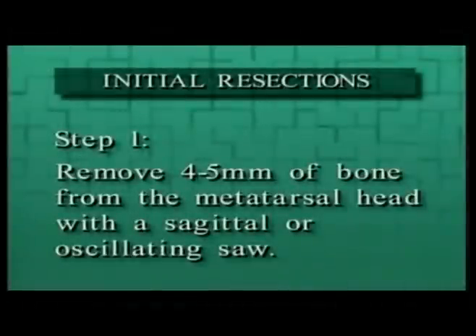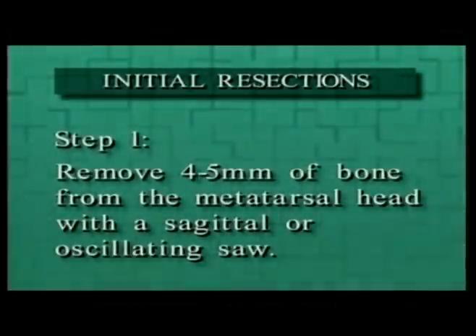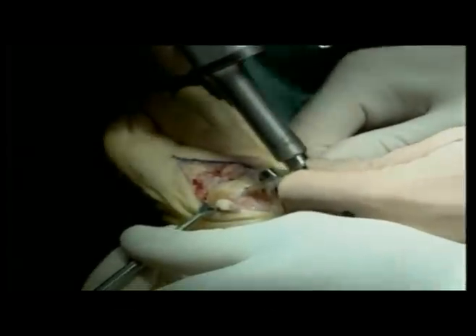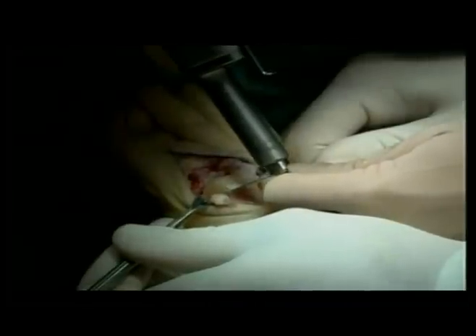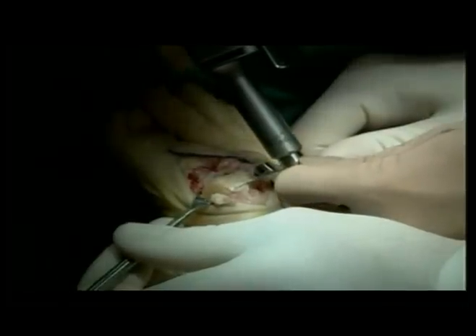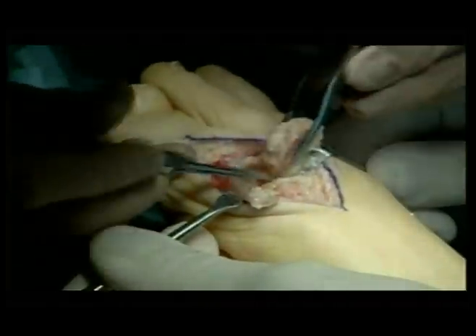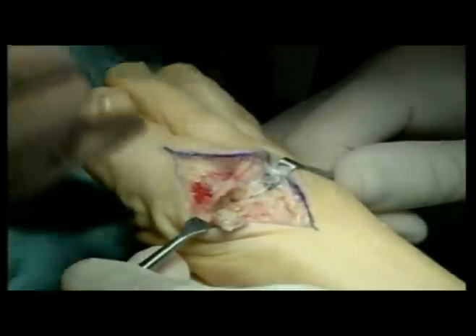Initial resections. Step 1: Remove 4 to 5 mm of bone from the metatarsal head with a sagittal or oscillating saw. Orient the blade to remove more bone dorsally versus plantar. The bone cuts are performed to create a relatively flat surface on which to start the guide pen and to create space to plantar flex the hallux in order to access the canals of the metatarsal and the phalanx. This cut is not critical to final implant fit, position, or alignment.